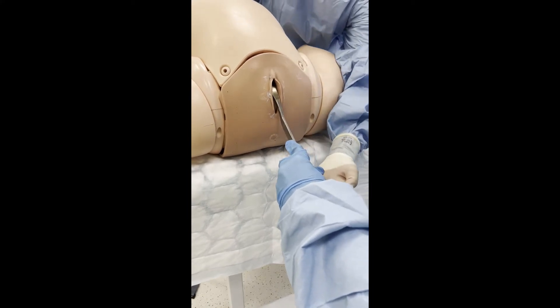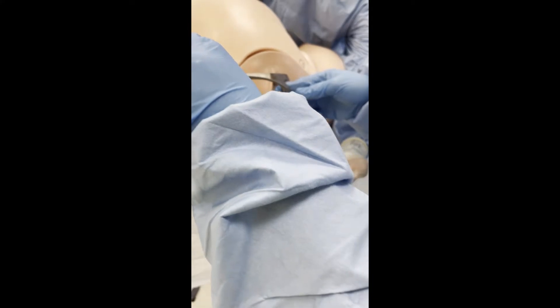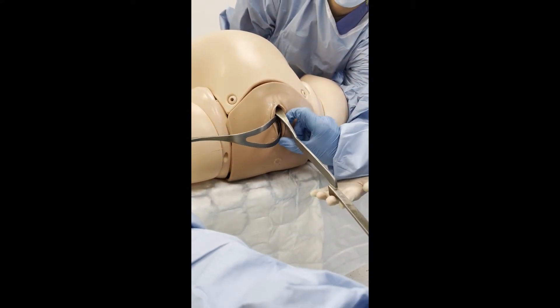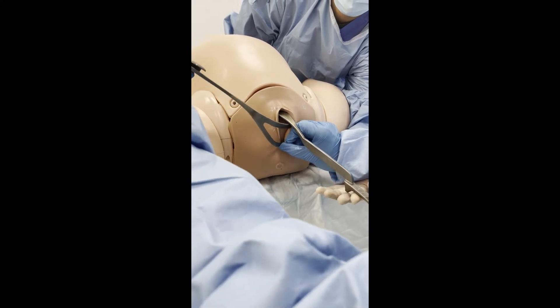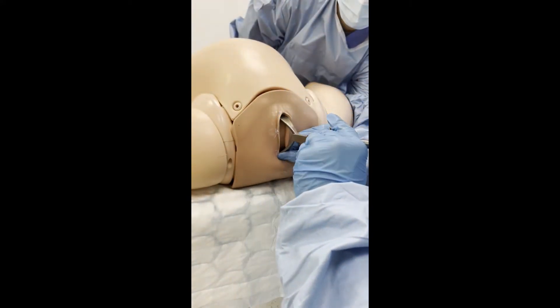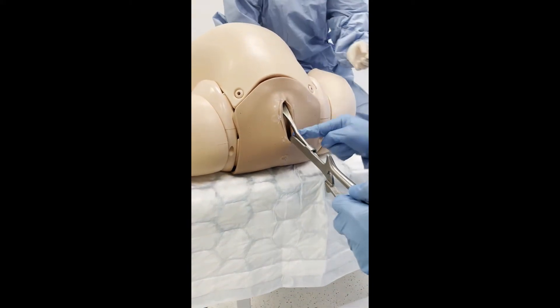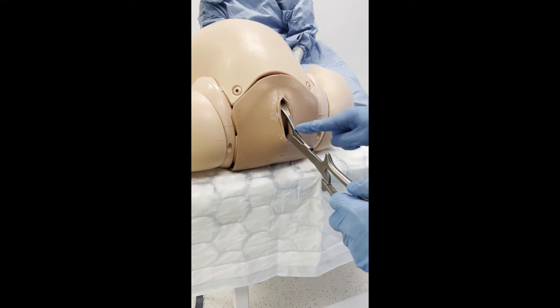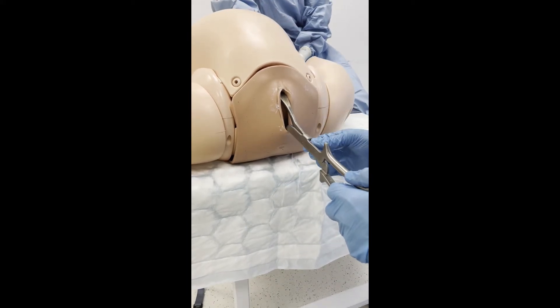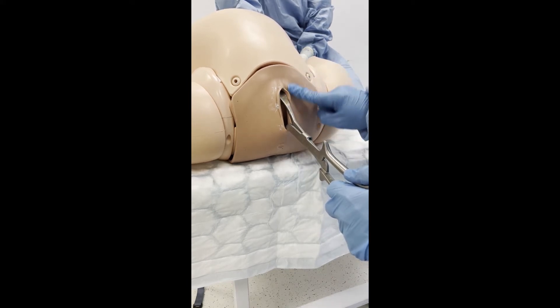The posterior forcep is inserted with the blade in a horizontal position, pointing towards the fetal occiput, and then carefully glided and manoeuvred 90 degrees, introducing it along the sacral curve. The posterior blade has become the anterior handle in this demonstration. This is why the anterior forcep was applied first — to allow the lock of the posterior forcep to drop onto the shank of the anterior forcep.